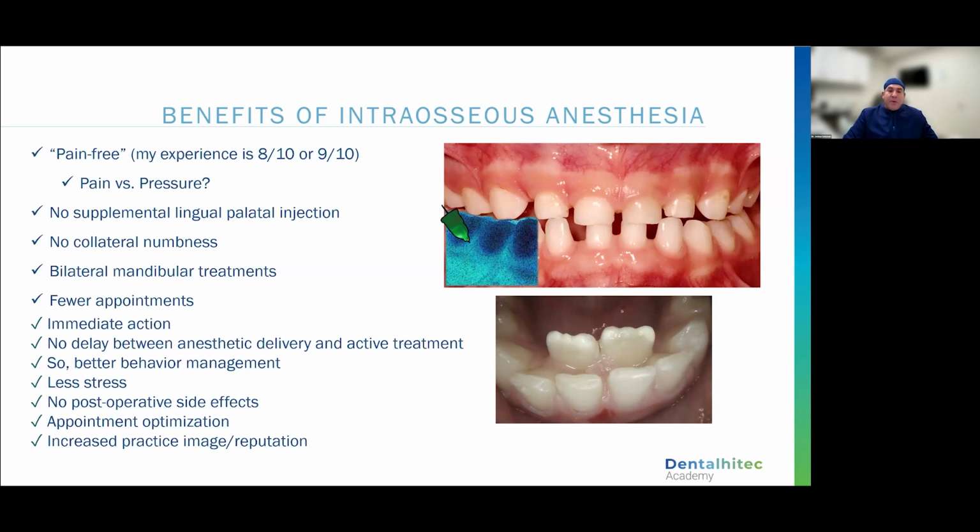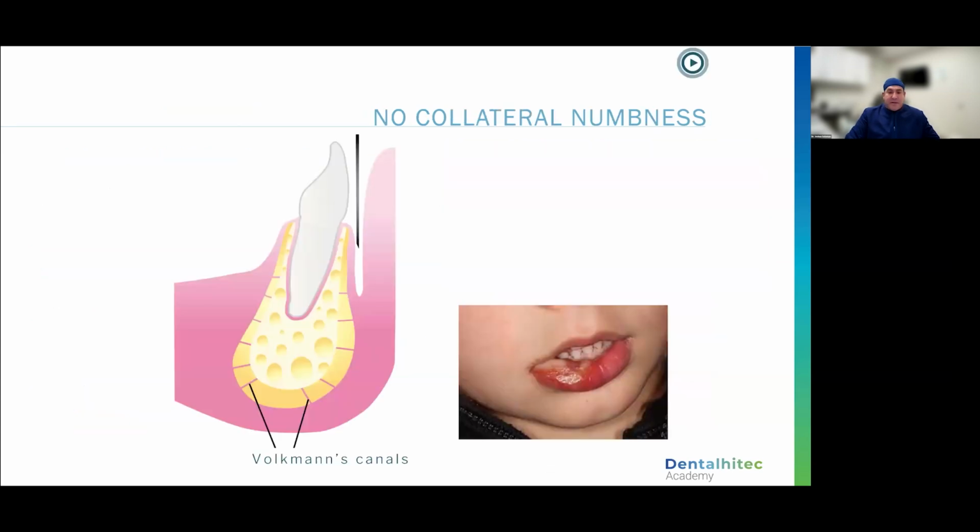All right. We all know that a happy parent makes everybody happy, and a stressed out parent is sometimes, we have those families where you have two patients in the operatory, if you know what I mean. And I will tell you that I've noticed a marked difference in the affect of parents during procedures when they know that I'm giving an injection. I often will look up and make eye contact with a parent and their mouth is kind of open because they just can't believe that their 3-year-old literally didn't feel the injection. That parent in their mind already had, oh, this is going to hurt, even though they told me it didn't. And to see that look on parents' faces is amazing. And I'll talk about this case here in a minute.